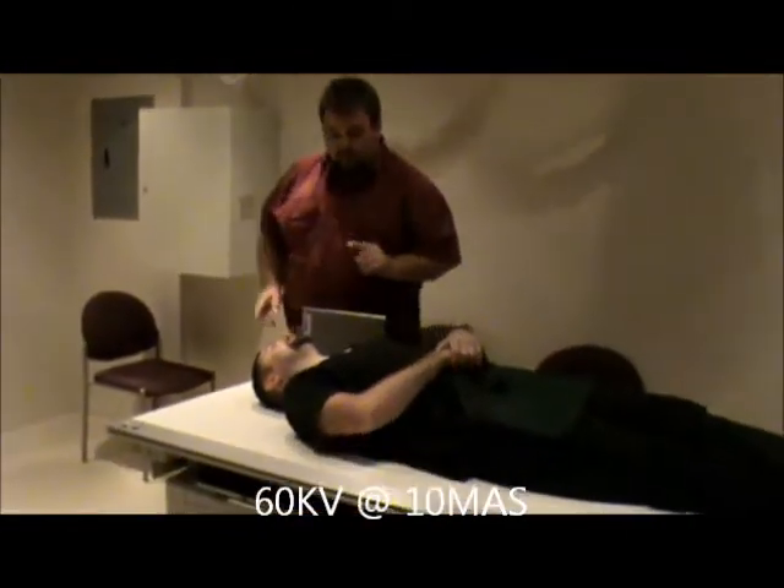Now the patient could either come in with a collar on or without the collar. We do not remove the collar for the exam. A physician routinely wants to see this x-ray done and it will be cleared before the collar comes off. You do need to annotate on the film whether it was taken with the collar on or off. Also make sure that if the patient has a necklace or earrings, if you can reach through the collar and take them off, you want to try and get them off if at all possible.